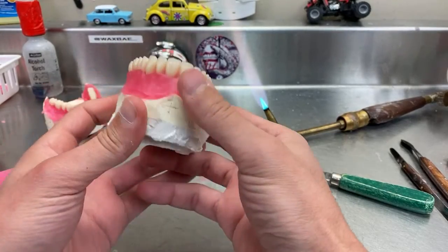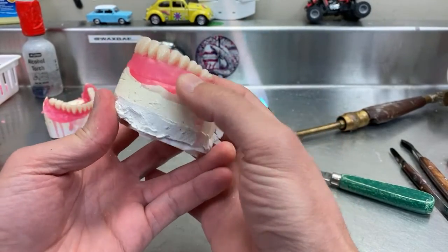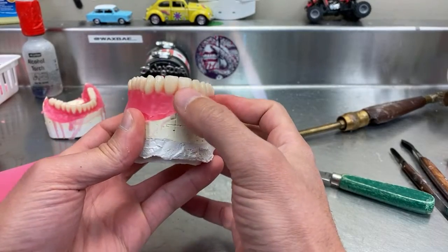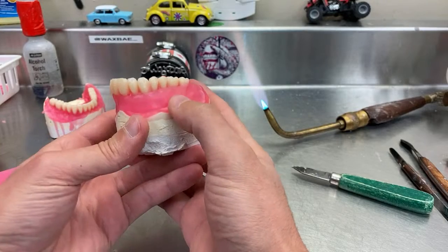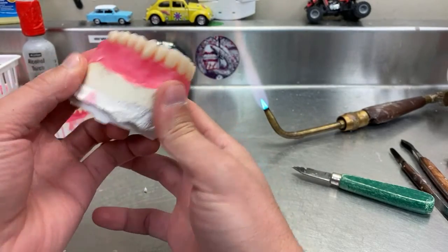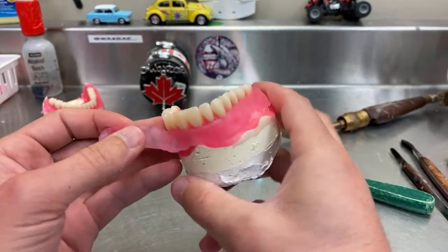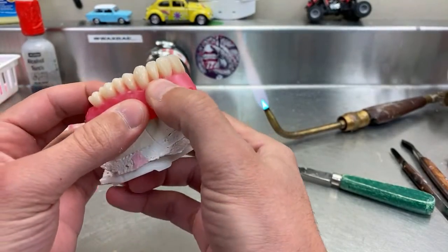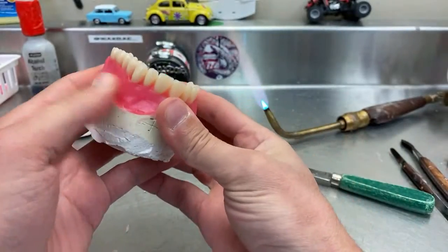Okay, so basically what I'm doing here is I heat up the wax, not very hot, kind of warm it up till it's soft and pliable. And then I put it on the low areas and start pressing. Not on the teeth, because if you push on the teeth and the wax is hot, that tooth will move. So you press here, and then as the wax moves, you can push it towards the teeth. And once you feel the wax is getting cold, stop, because now you're going to delaminate, like here. If I keep pushing on this, look at that. That's chaos. So once the wax is cool enough, just let it be. I'm sure I'm going to get delamination here, but who cares? I was using it as an example. Sometimes you have to sacrifice.